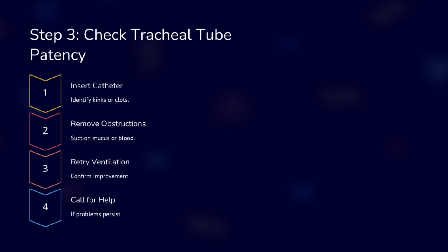Now step 3 is to check tracheal tube patency. So we can insert a suction catheter to identify any kinks, compression or clots. We can remove obstruction by suctioning, so we can remove mucus or blood. We can retry ventilation after trying to clear the tube, and if problem persists, we can call for additional help.